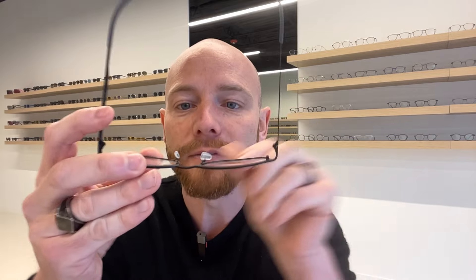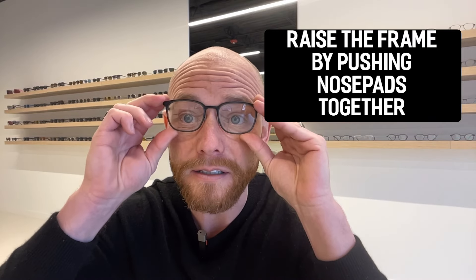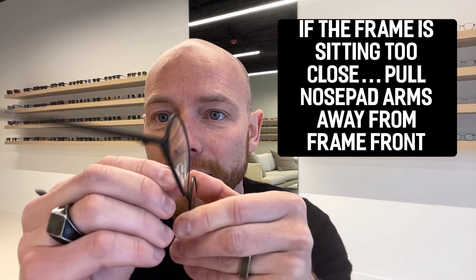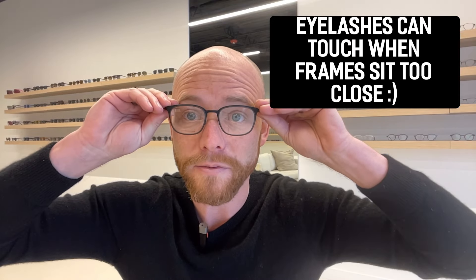The opposite is true as well. If you push those together and bring them in a little bit more, you're going to raise the frame on your face. But maybe your frame is also sitting too close to your face — you can pull the nose pad arms away from the frame, doing the same on the other side with even distribution, and this sets the frame further away so it's not sitting so close.